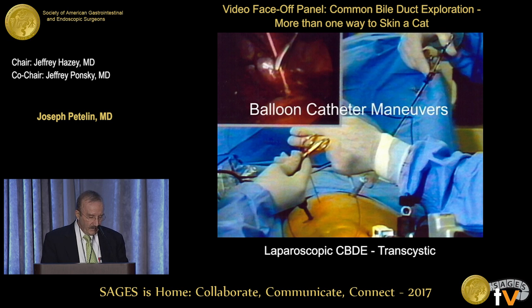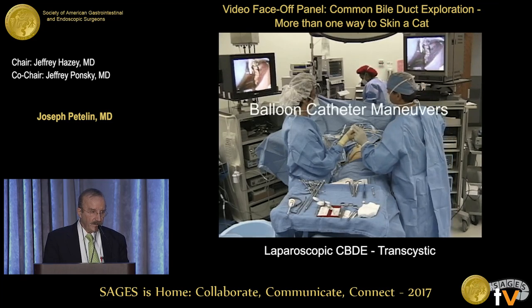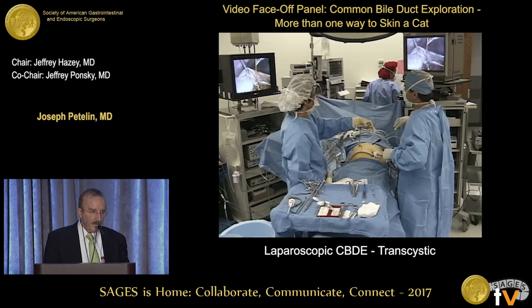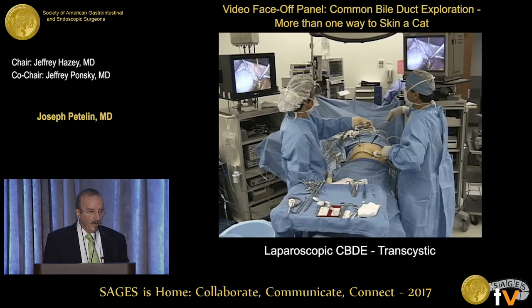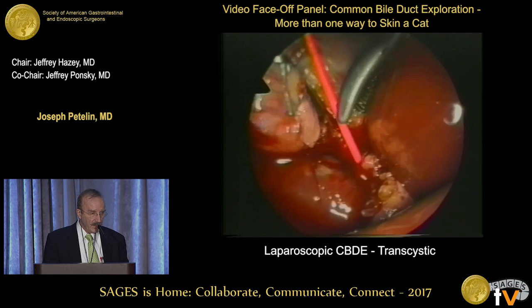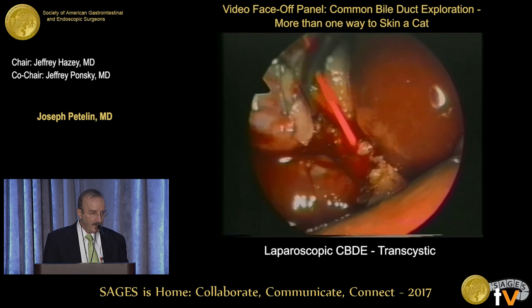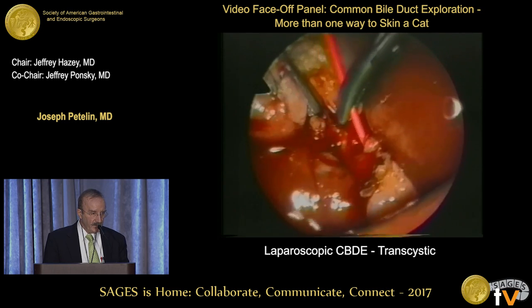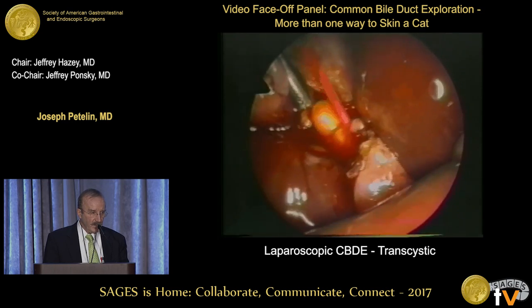So the way that I first did a common duct exploration laparoscopically back in 1990 was to use a 4-French Fogarty catheter and drag it back through the duct. And this is actually from a video back from 1990. You'll see a couple of cholesterol stones emitted through the cystic duct.